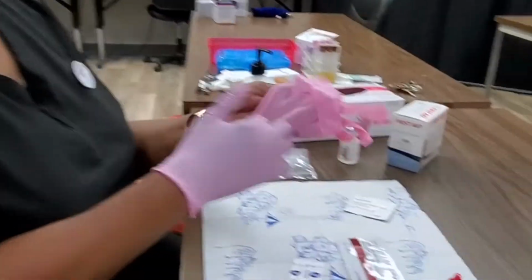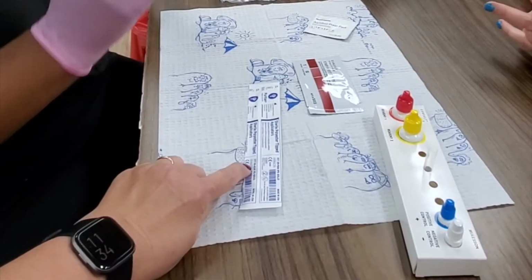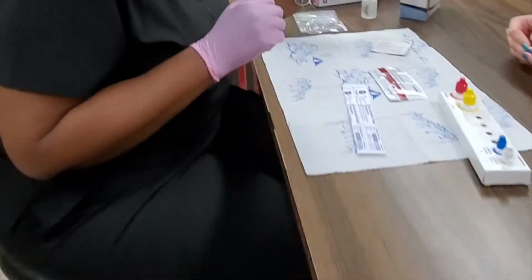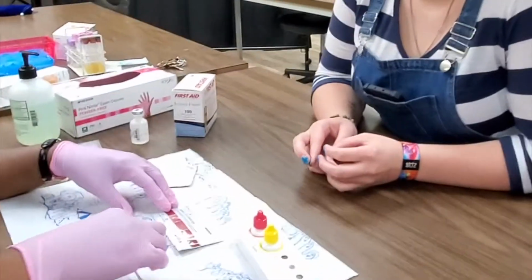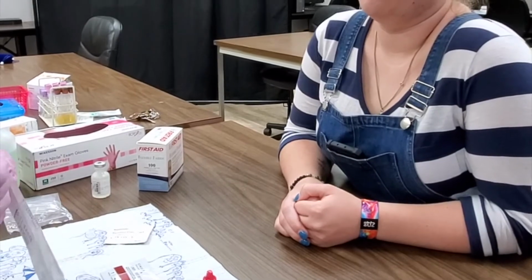The items that we're going to need will include the sterile tipped applicator, the reagent strip, the reagents, and the tube. So we're going to give directions for the patient. Go ahead and open up your swab. The patient will be sitting upright. For some patients, this can be a little bit uncomfortable.